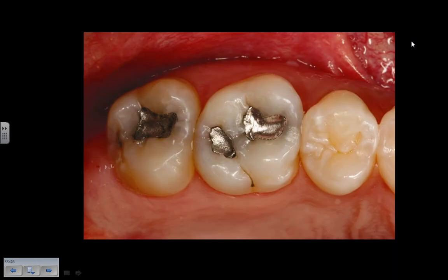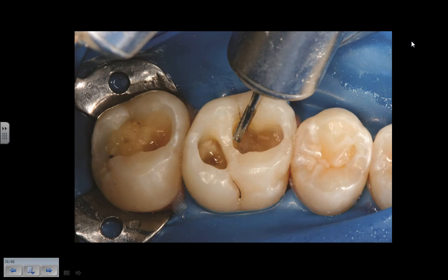For this circumstance, here we're not dealing with caries, but rather we see amalgam restorations that have somewhat of a ditched margin, but what makes them unacceptable is the patient's unhappy with these gray looking fillings. We're replacing these amalgams because the patient wants an aesthetic change. Our preparation's done with adequate air water spray and a high-speed handpiece using a cross-cut fissure burr. All the amalgam is removed.